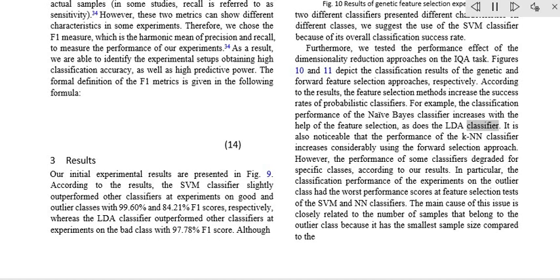Hence, automatic retinal image analysis systems can acquire high accuracy rates using these images. In fact, several retinal images acquired in clinical systems have insufficient information to diagnose the retinal diseases. These images are useless for automated image analysis systems and occupy redundant disk space. This issue can be resolved by assessing the image quality with the help of automated IQA approaches before such images are saved into automatic retinal image analysis systems. Therefore, the valuable time of ophthalmologists can be saved by eliminating the inadequate retinal images. In other words, IQA will improve both the quality and the time efficiency of the retinal image diagnostic process.